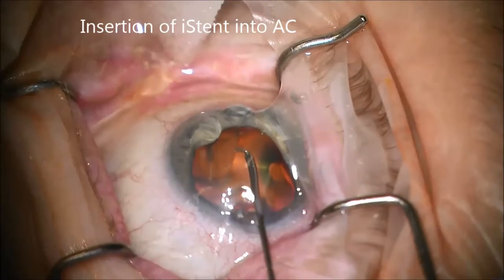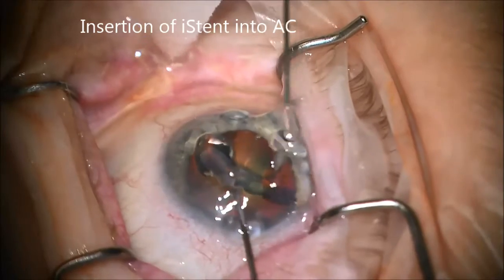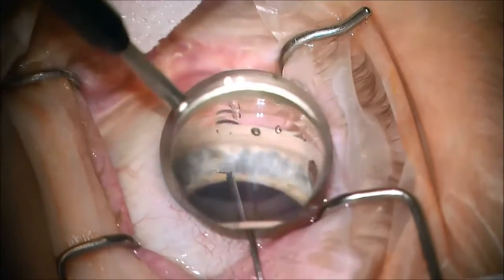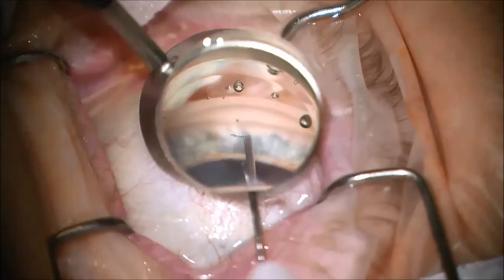The iStent is easily placed through the small wound into the anterior chamber, and the viscoelastic is placed on the surface of the eye, followed by a gonial lens.